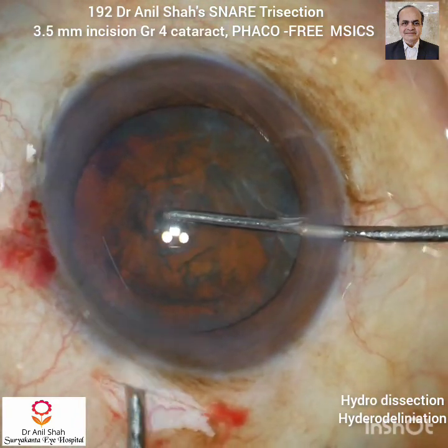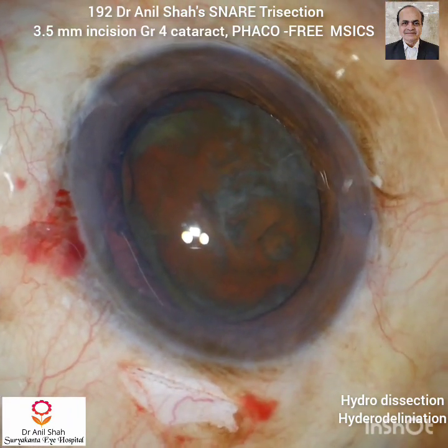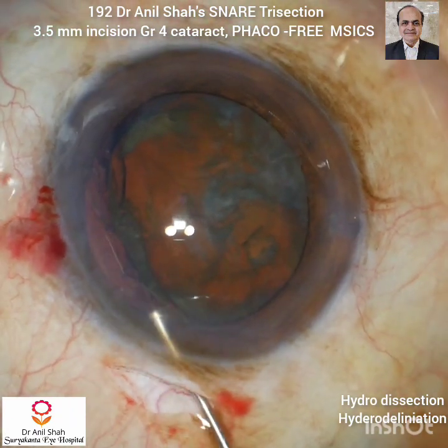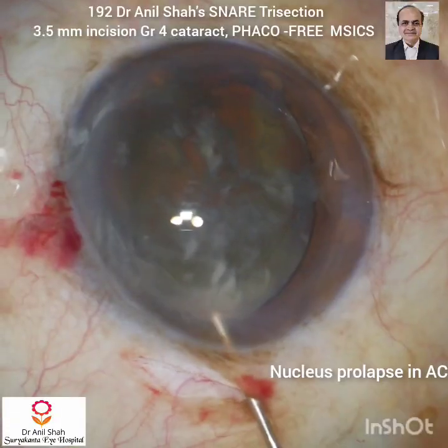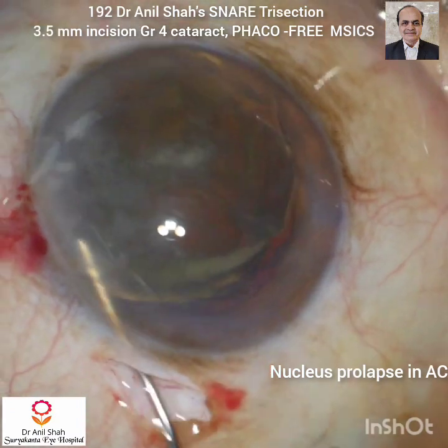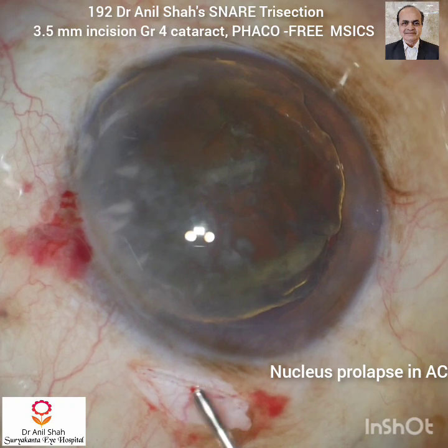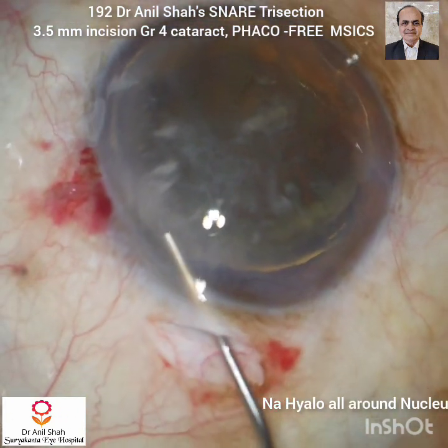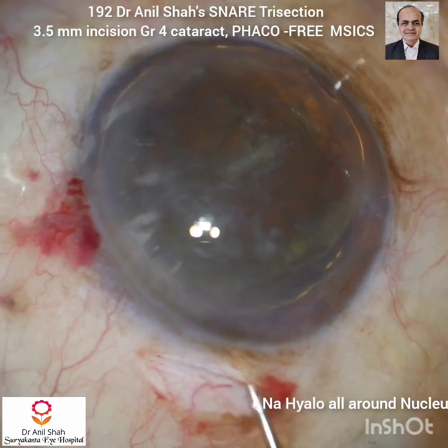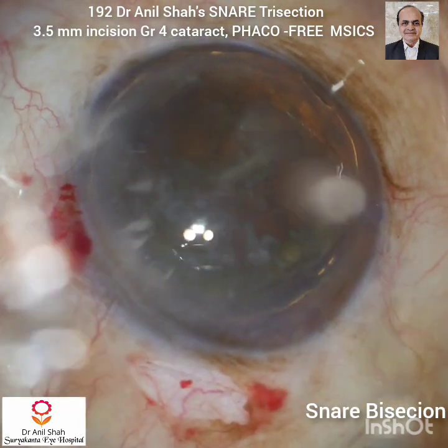Now with the Sinskey hook the nucleus pole is lifted so that one pole comes above the capsular rim. Now with sodium hyaluronate and the cannula I take the nucleus out into the anterior chamber and rotate it. I push sodium hyaluronate into the angle so the iris goes behind, then onto the anterior surface of the lens and also into the angle so that the nucleus should be free floating.